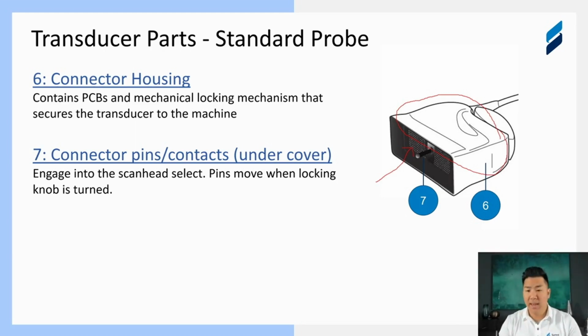Keep those clean if you can. No fluids in this area when decontaminating transducers. Avoid that at all costs. But do keep these pins clean, with some isopropyl alcohol if there's any issue there. Keep dust bunnies out of there. We've seen dust bunnies cause shorts across these pins, which cause some pretty severe damage. But in just talking about this part of the transducer, it's typically pretty robust. We don't see too much damage down here. Typically more on the crystal and lens side towards the front of the transducer.